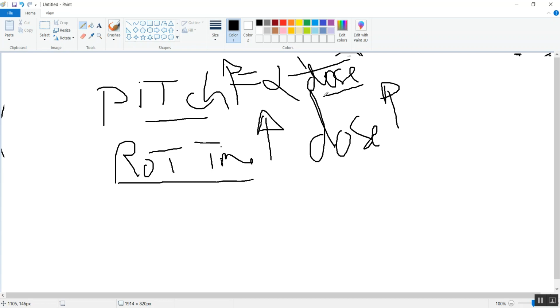So make sure your pitch factor is less than 1, especially if you want to scan fine details regions like the petrous bone, brain, or wrist joints. But you can increase pitch factor greater than 1 in large organs like CT abdomen pelvis or chest region.